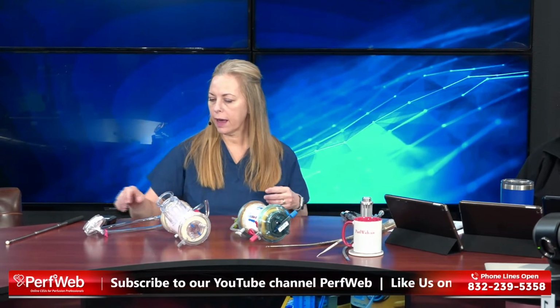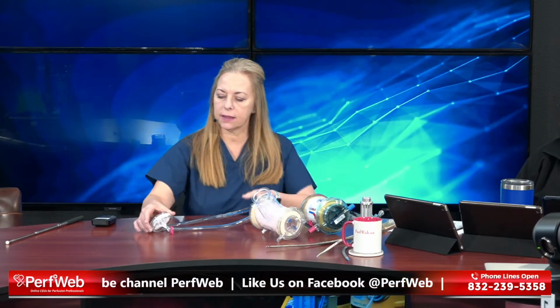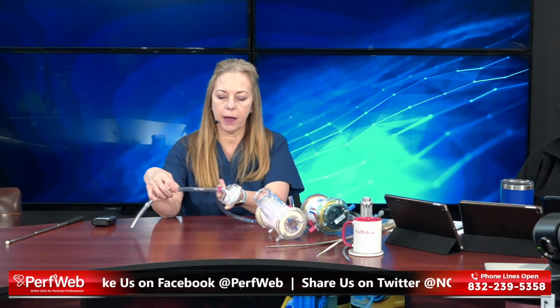Welcome, everyone. Happy Friday. Let's get started with the blood pump. Now, this is the LivaNova Revolution. Many of you may be familiar with it. It's the same kind of blood pump, a centrifugal pump that comes in a regular bypass pack. We are very happy with it. We also use it in the operating room on our cardiopulmonary bypass system.